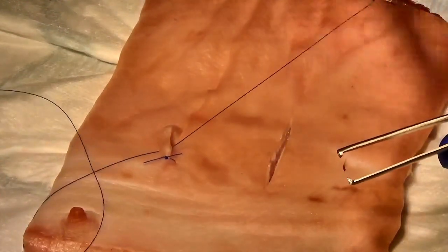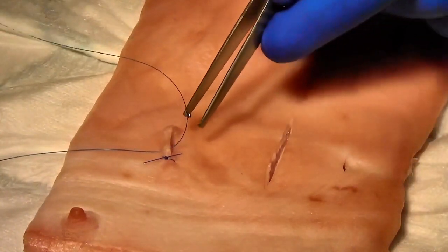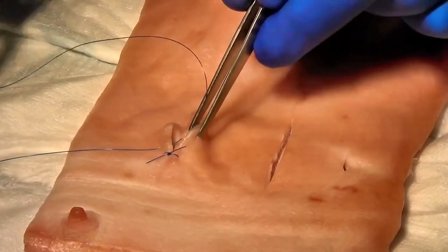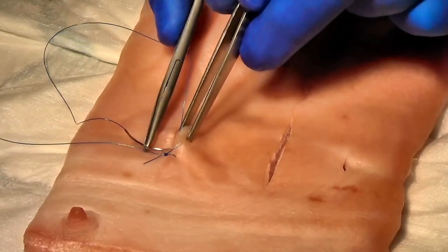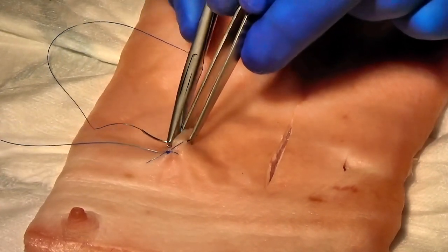And note, I've rotated my hand to take that out. And again, try and make it equidistant.